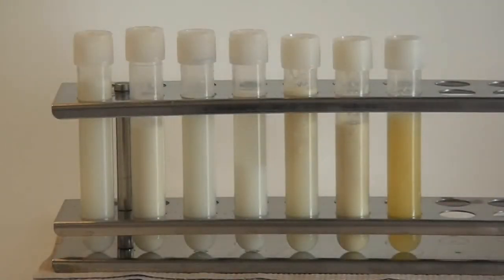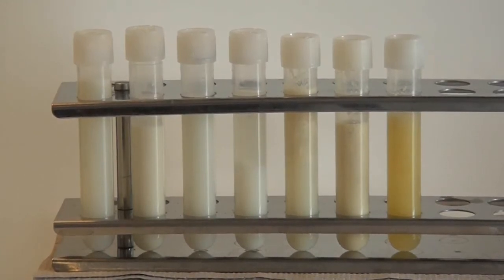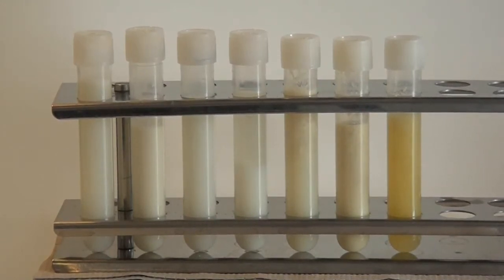Tubes from left to right contain udder secretions in decreasing quality, from clinically inconspicuous to strongly impaired. When these secretions are moved, clots become more visible in some tubes.